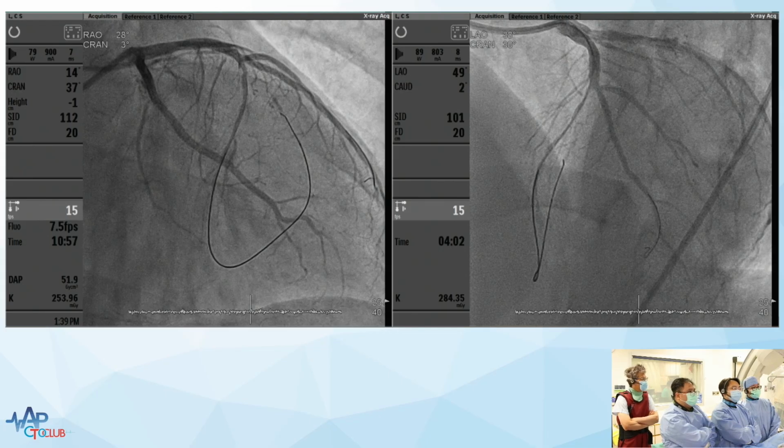So maybe we should do that. Even with a single guide using the ipsilateral collateral, after this guide wire passes through the CTO region, maybe we can do guide wire trapping using the branches, and for the insertion, the microcatheters. So, yep.